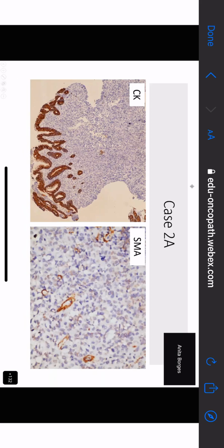Ask for annotation. Yes, ma'am. Where is it positive? Yeah, ma'am. Okay, that's where you think. What about this? Is that also positive? Yes, ma'am. But it looks like a vessel. That looks like a vessel. And so what you marked, what was that? It was a tumor cell?